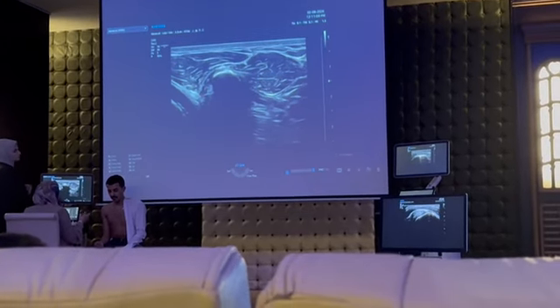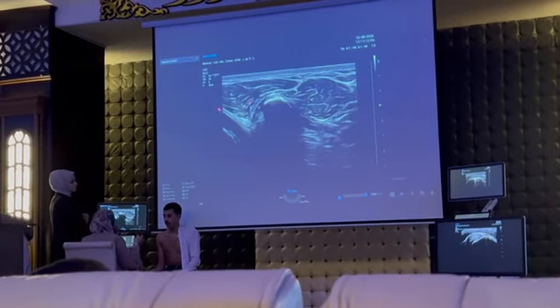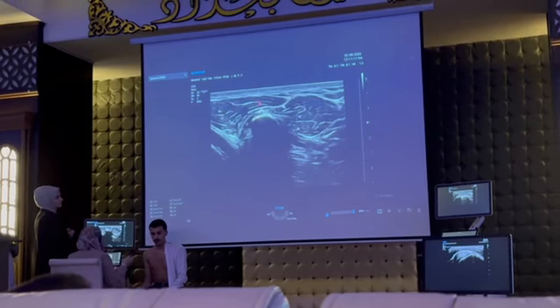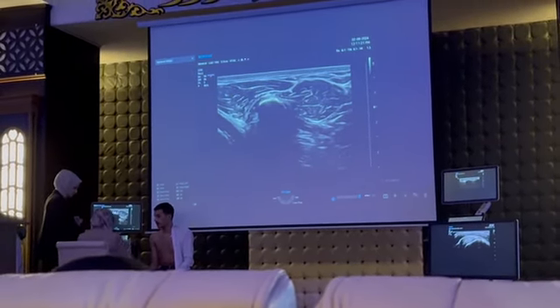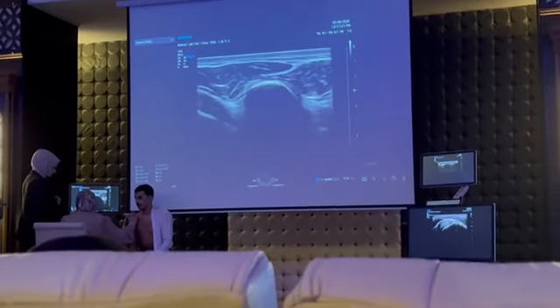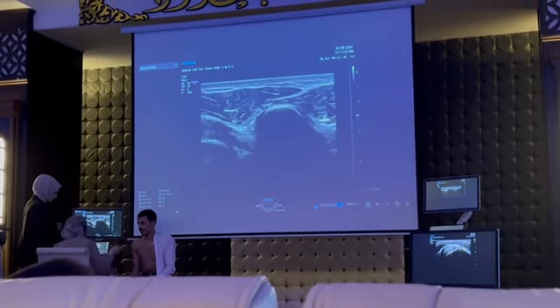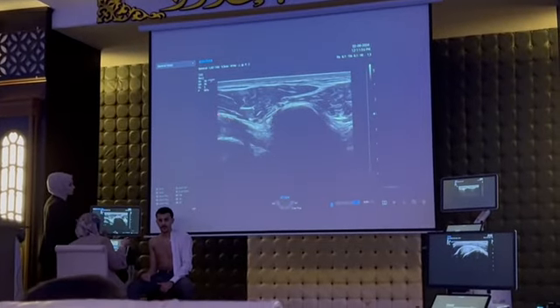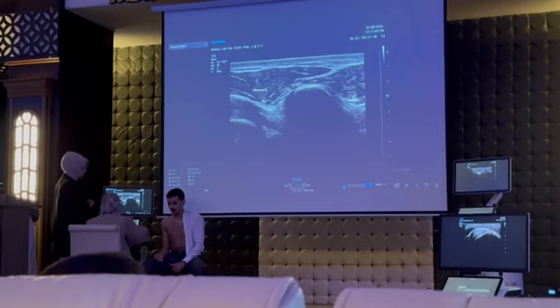So now we have examined the subscapularis, long head of biceps, and deltoid muscle. Every muscle that appears anteriorly is the deltoid muscle. Now go to examine the ligaments to complete the anterior compartment. The first ligament we see is the coracohumeral, which comes from the coracoid process toward the humerus, just above the subscapularis muscle. This is the first ligament that should be examined.